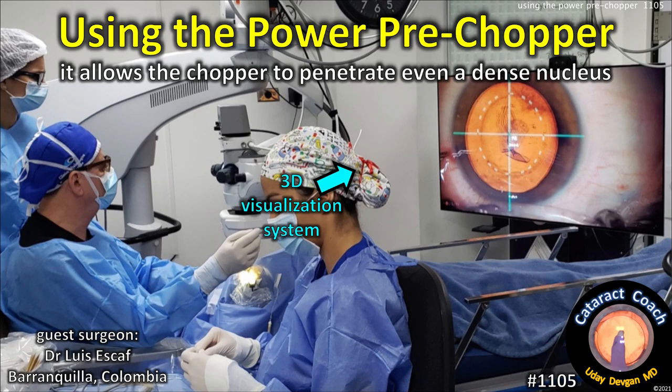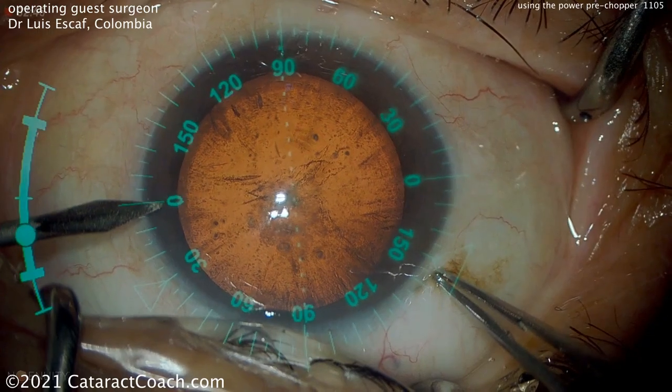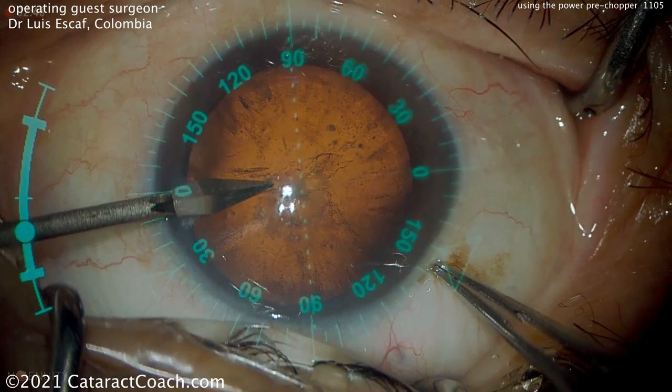CataractCoach.com. Using the power pre-chopper allows the chopper to penetrate even a dense nucleus. Our guest surgeon, Dr. Luis Escaf from Barranquilla, Colombia.